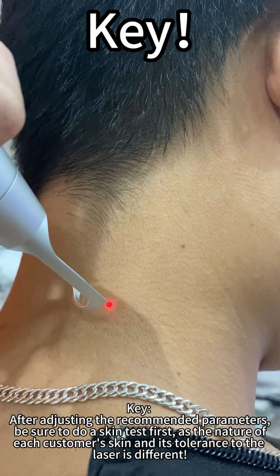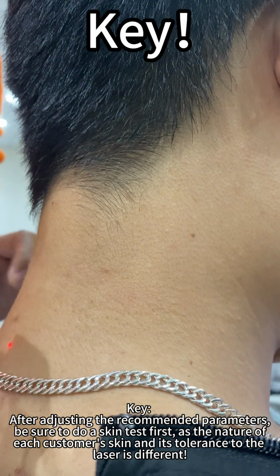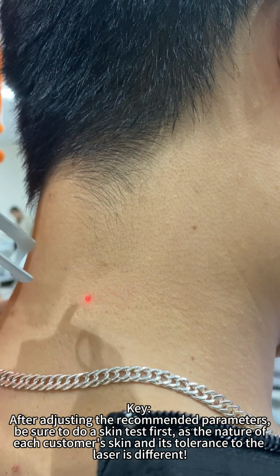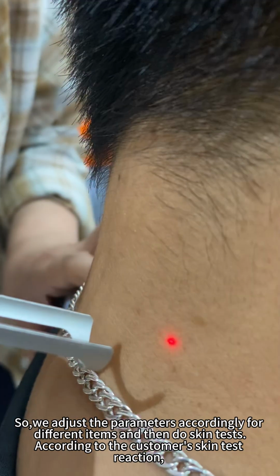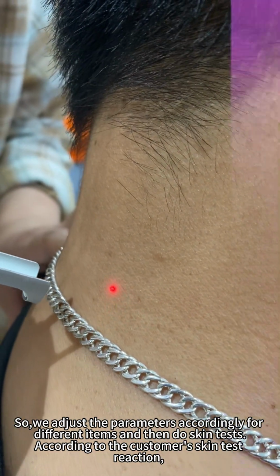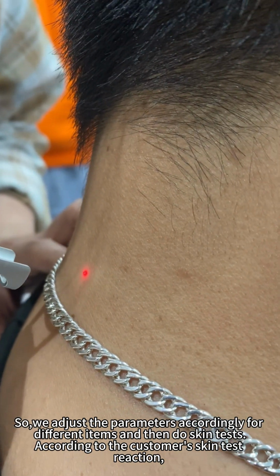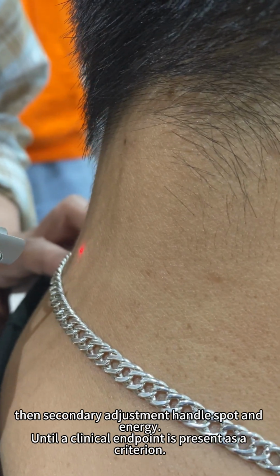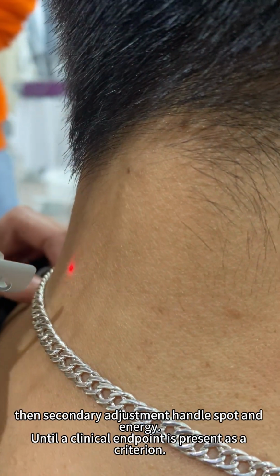Key: after adjusting the recommended parameters, be sure to do a skin test first, as the nature of each customer's skin and its tolerance to the laser is different. So, we adjust the parameters accordingly for different items and then do skin tests according to the customer's skin test reaction. Then make a secondary adjustment of spot and energy until a clinical endpoint is present as a criterion.